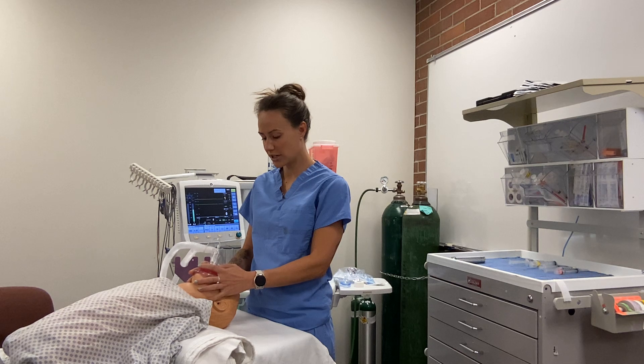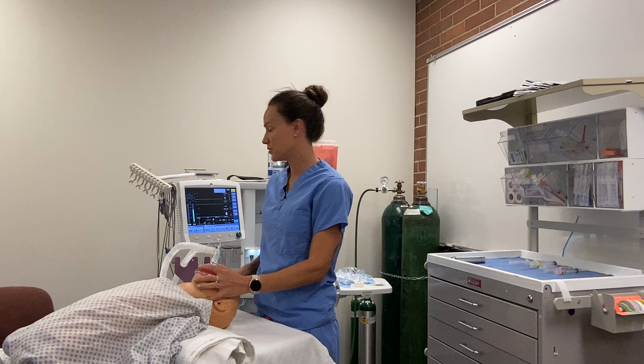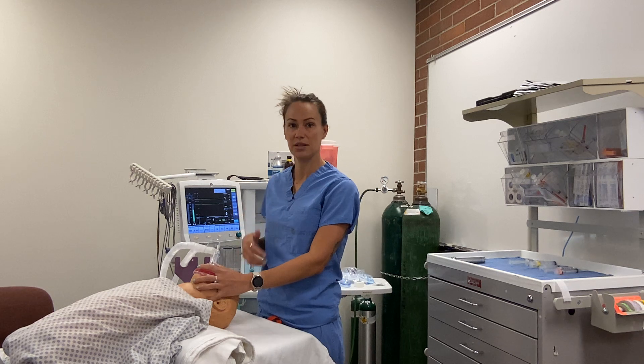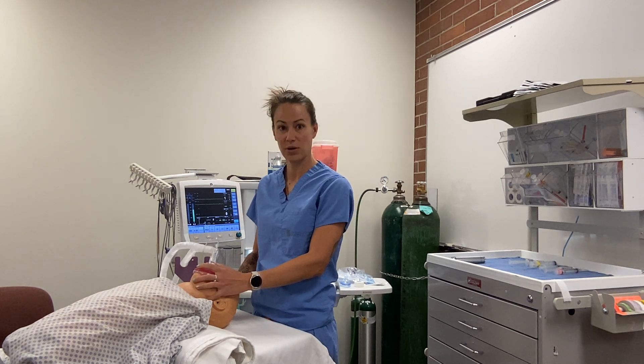To confirm the patient is actually getting the gas during inhalation induction, we look at the monitor to see that tidal volumes are present and check that end-tidal is there. As long as the patient is not holding their breath and is breathing in the gas, they will go to sleep.